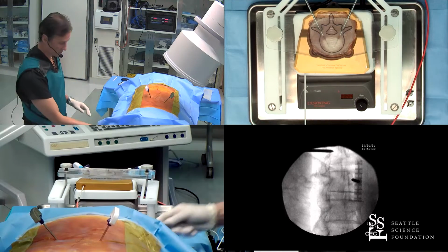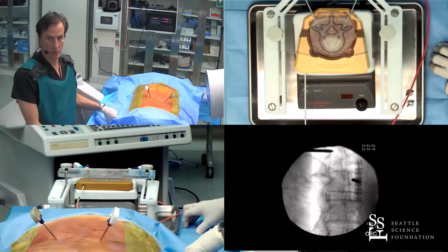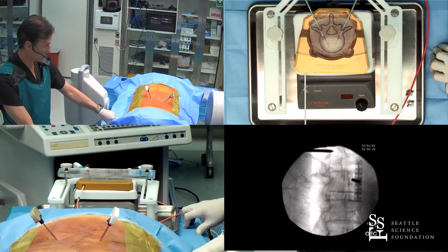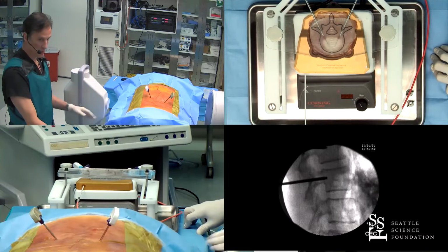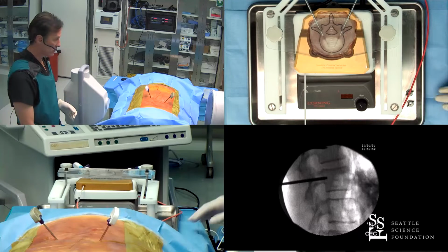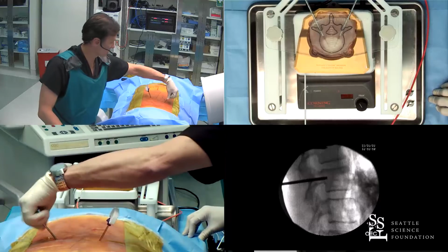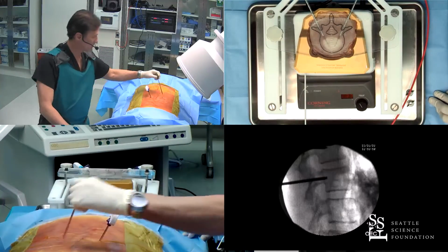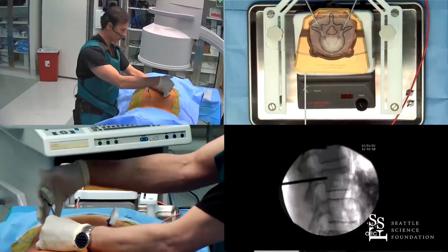And we'll look lateral. This is called the en face approach, or the gun barrel approach, or the straight down the pedicle approach. So we're in the posterior portion of the vertebral body, easy enough. So we'll come back around to AP. I'm going to re-access the level that we had at the transpedicular approach, going through the same access point.